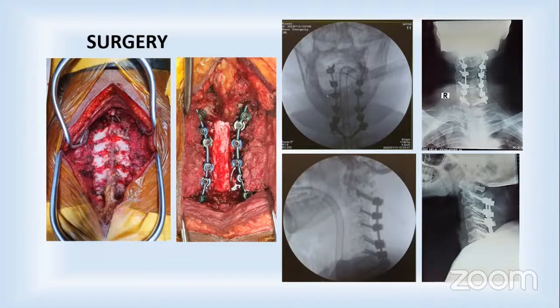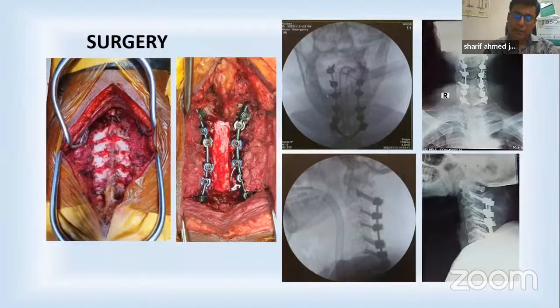You are absolutely right. But the problem is that the hospital where I am working right now has very limited facility for doing laminoplasty, because we do not have the tools to do it for this patient. And I think that if I do a cervical laminectomy, that may cause iatrogenic instability. That's why I put in the instrumentation. To me it seems easier, as you know that lateral mass screws as well as C2 and C7 pedicle screws are very safe for the patient.